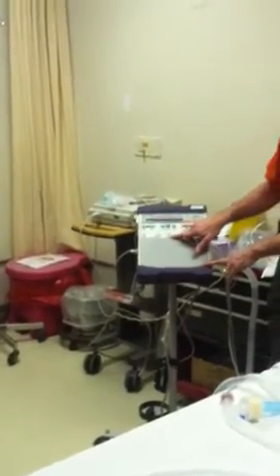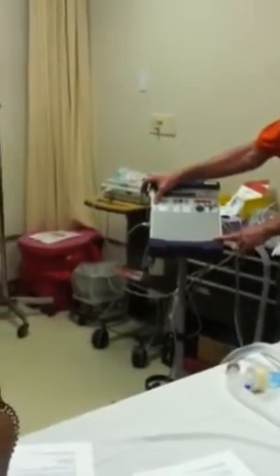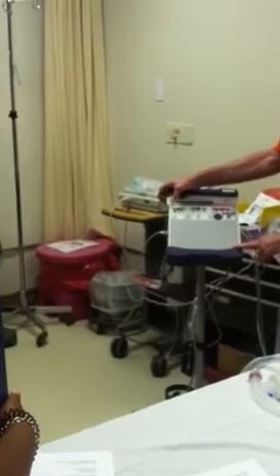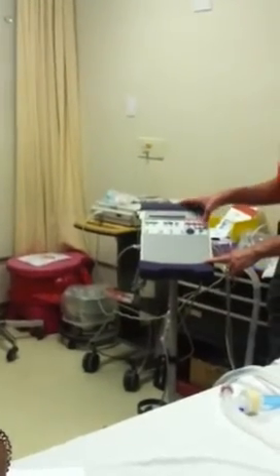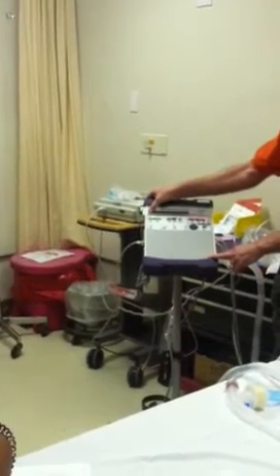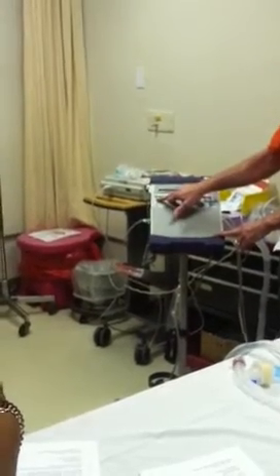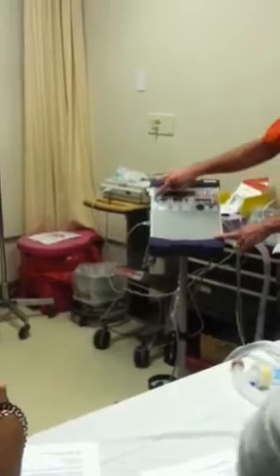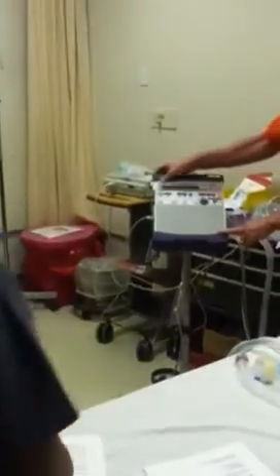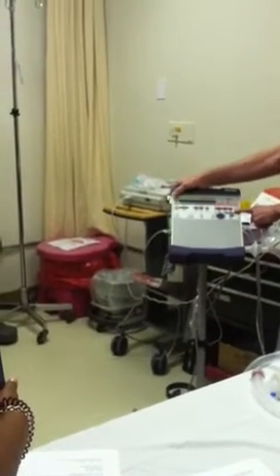Just by hitting it. Now if we run a blood gas on them and the doctor says their CO2 is too high, they're in assist control, and he says, let's speed up their respiratory rate so that we can blow off some of that CO2. Can you go ahead and increase the rate for me? What you do is you hit that button, whatever you want to change.